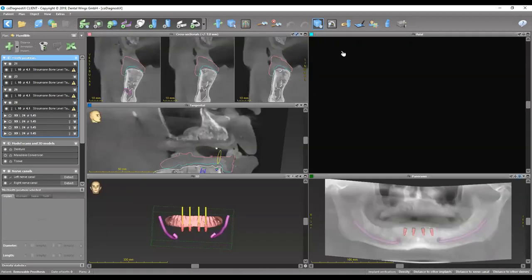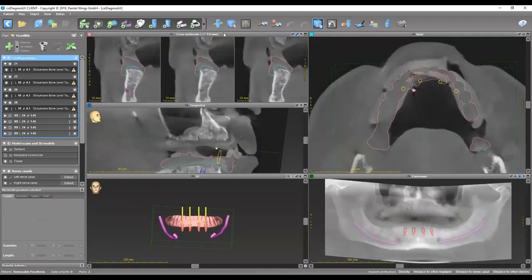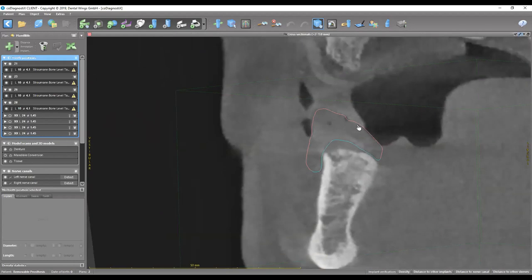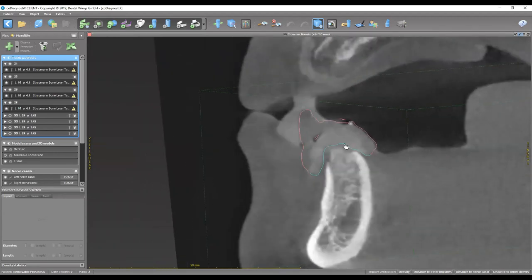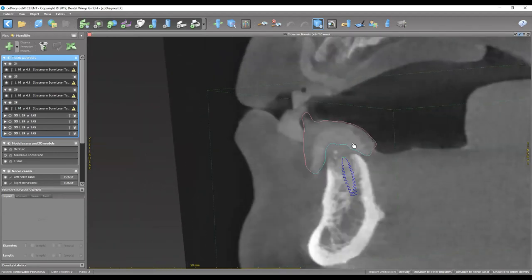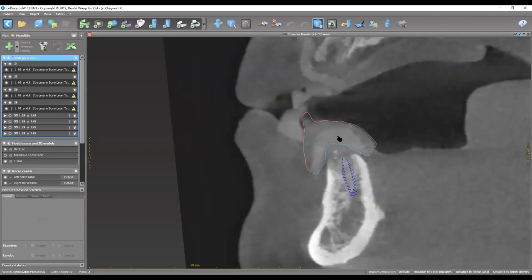Taking a closer look from the cross section, we can see the patient's anatomy or dentition, the shadow, and the flanges buccally and lingually. Right here we can also see the relining material — the radiopacity of the relining is visible from the cross section, confirming the denture was relined.